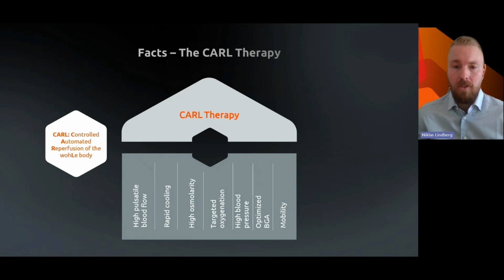We also apply the concept of mobility. So we know that the cardiac arrest patients can be transferred from out of hospital or they can be transported in the hospital.